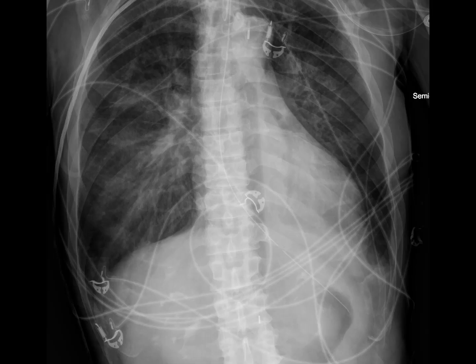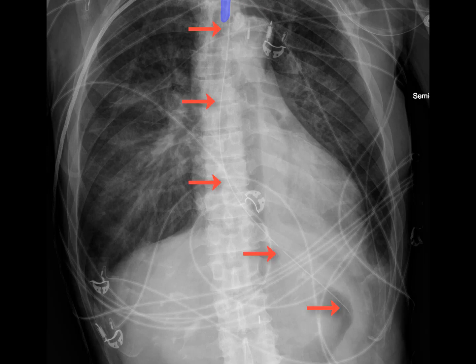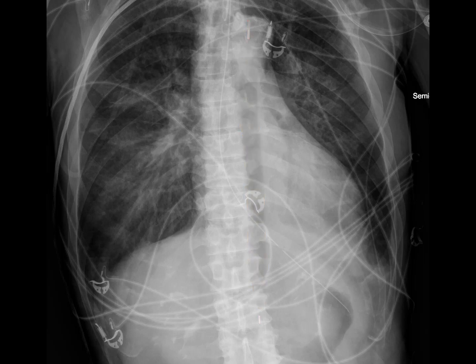Here we have a very complicated chest x-ray with overlying cardiac leads, an endotracheal tube, and a nasogastric tube extending into the stomach. This patient has an intra-aortic balloon pump that is partially filled with helium gas. Helium is used because it can be rapidly inflated and deflated with every cardiac cycle, and if the balloon ruptures, helium will be rapidly absorbed and shouldn't cause embolization or blockade. There are radiopaque markers at the proximal and distal end of the balloon, with the proximal end in the aortic arch, perhaps a little too close to the origin of the left subclavian artery.